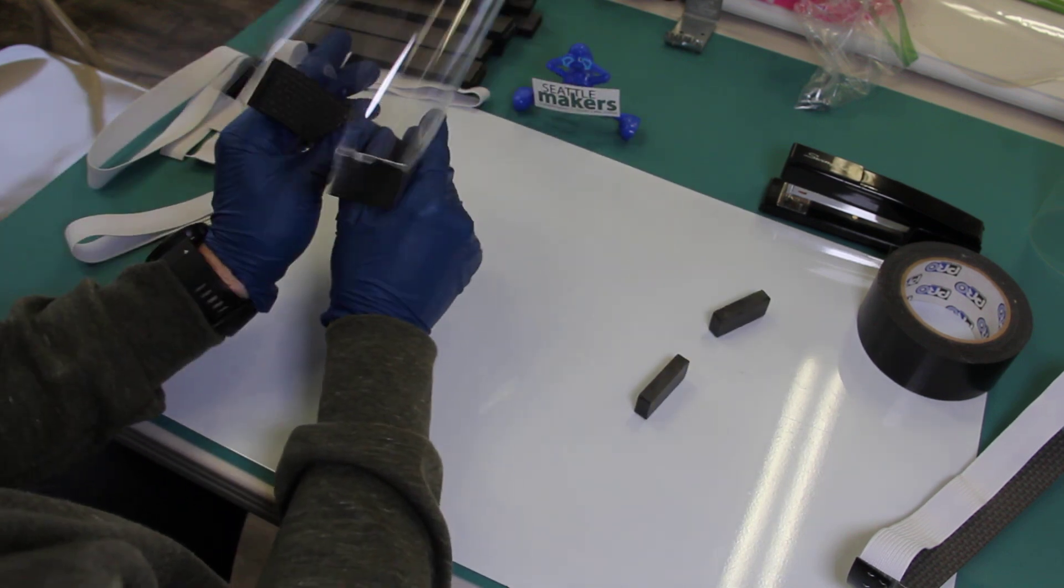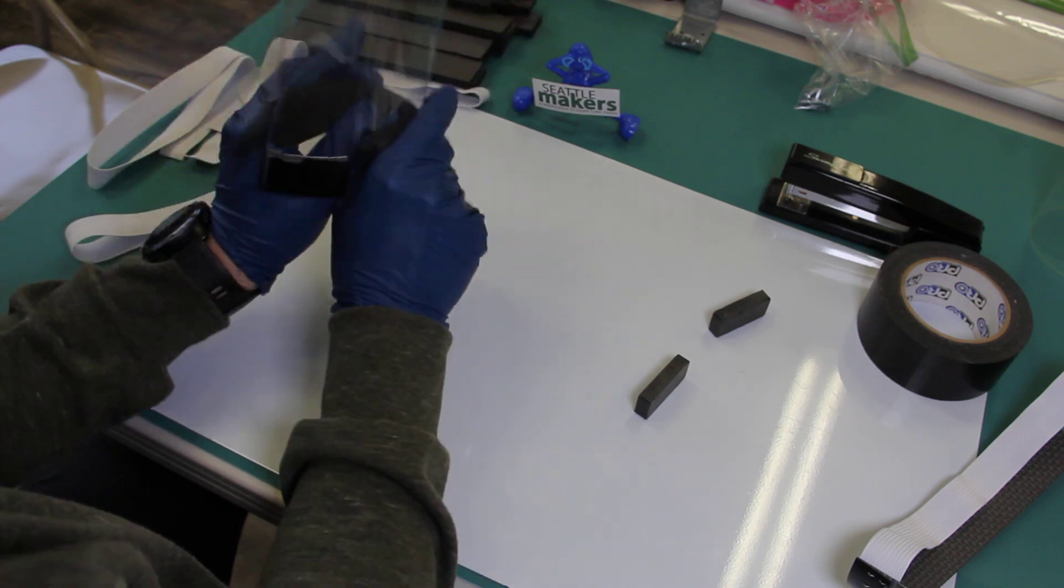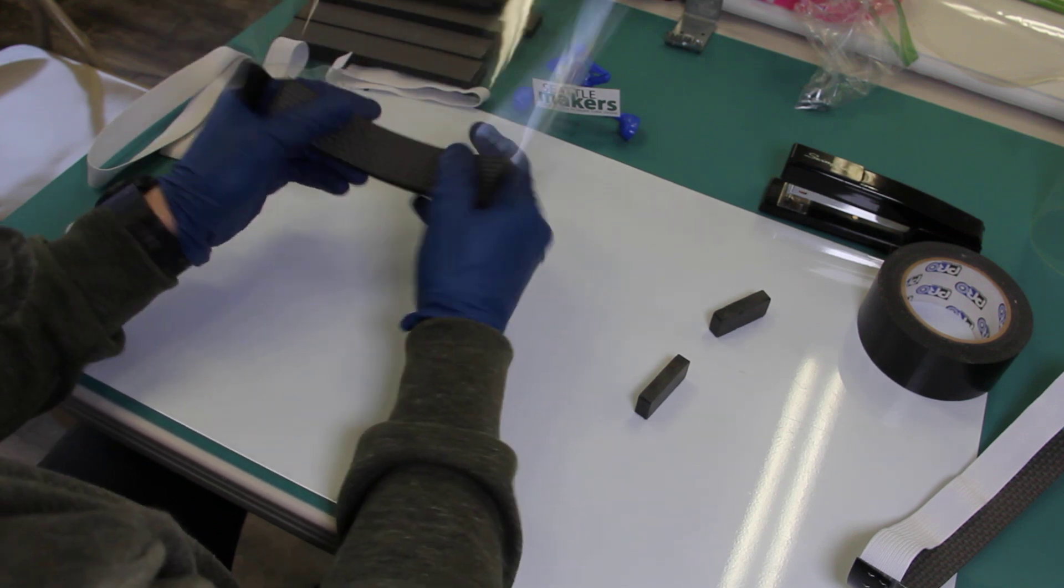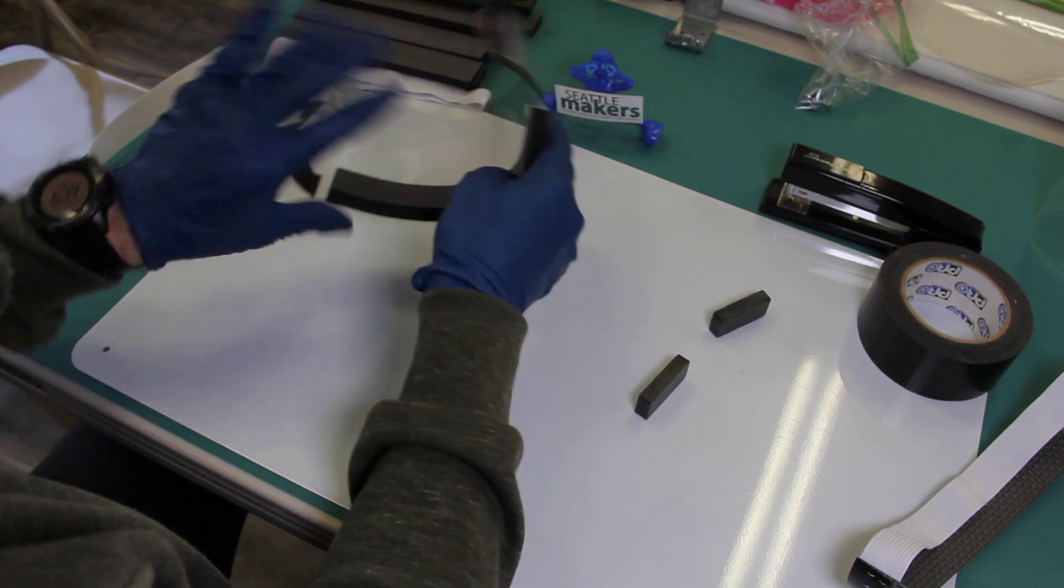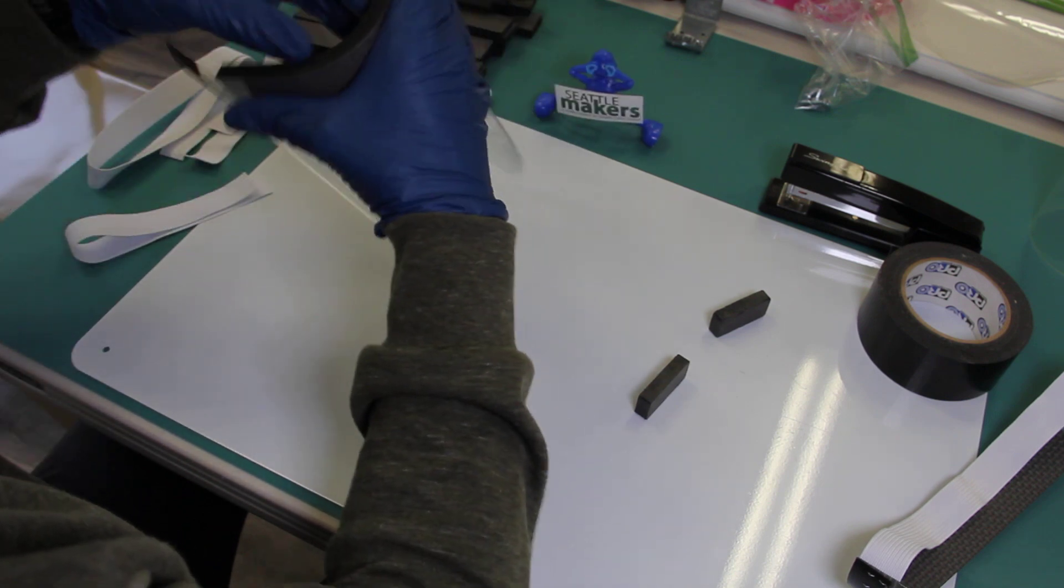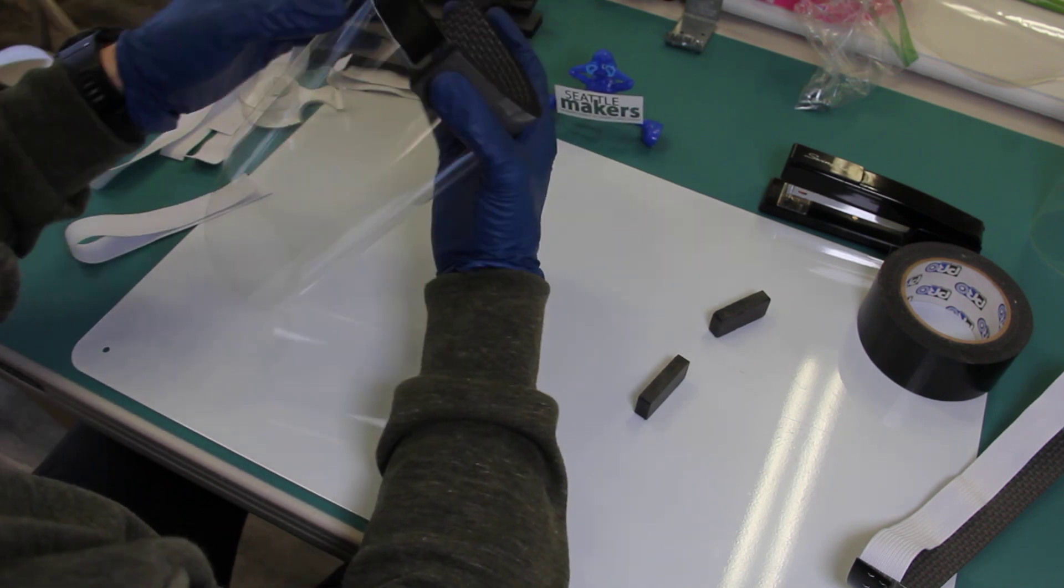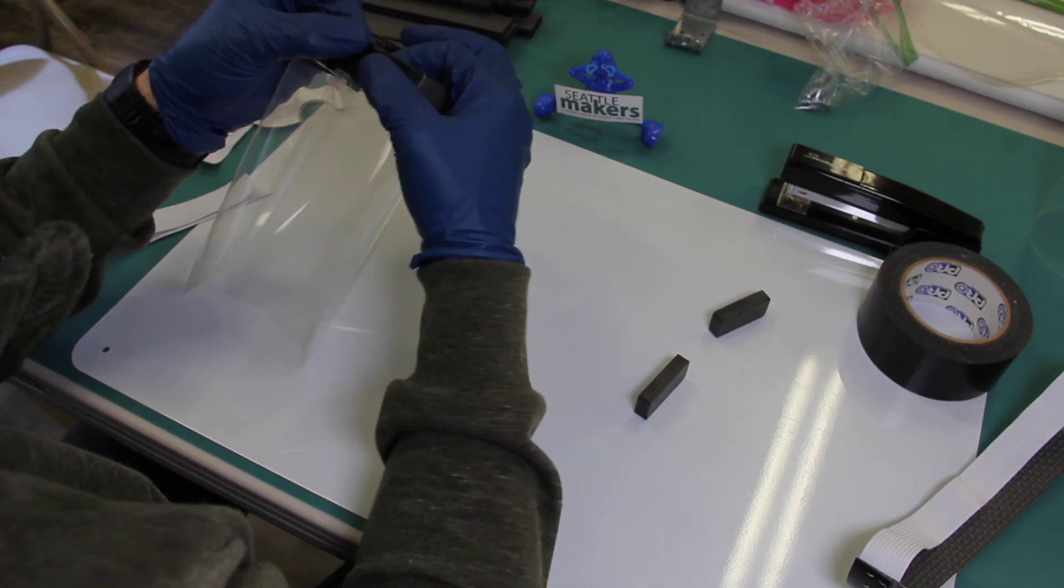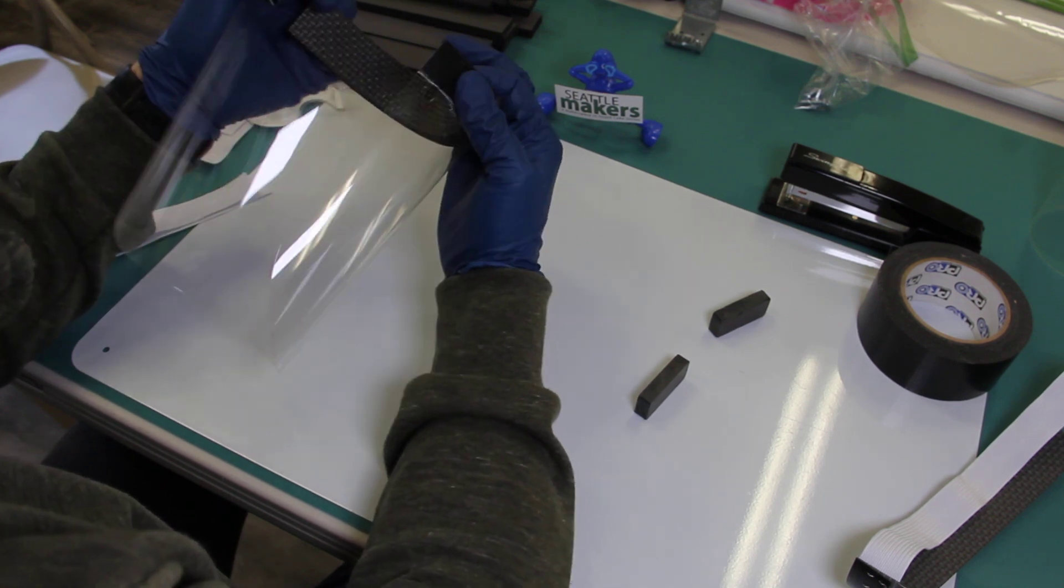You can bend some curve into this, and you might want to do that before the adhesive really sets up. Get a curve in there. It's going to bend pretty easily when you get it onto your face. And then the next step is to attach the elastic onto the back.